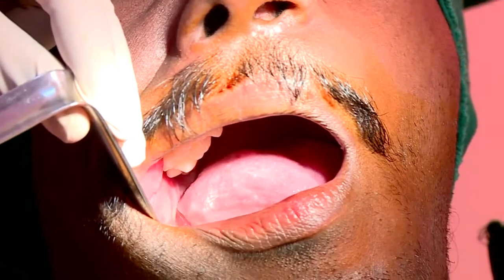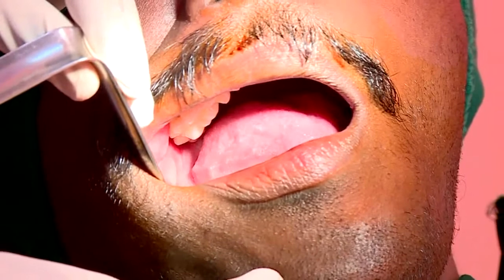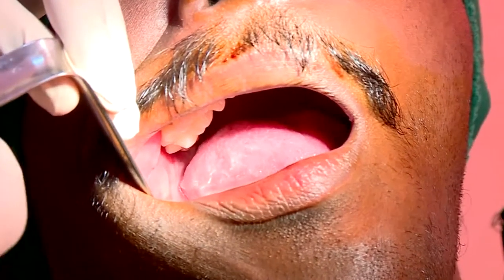So we can see the distal aspect of the crown here. Okay, this is a horizontally impacted tooth with position A. The highest point of the impacted tooth is at the level of the occlusal plane.